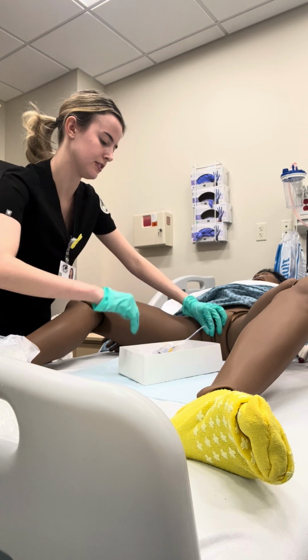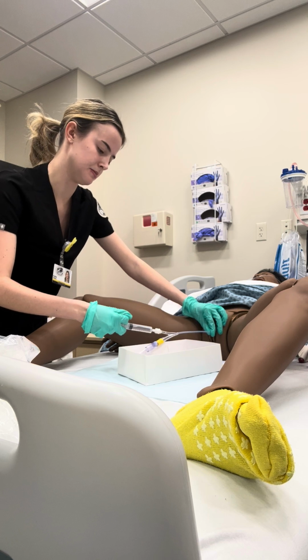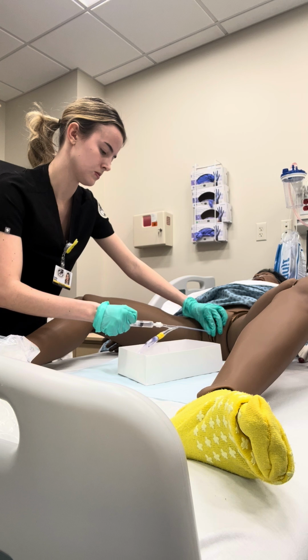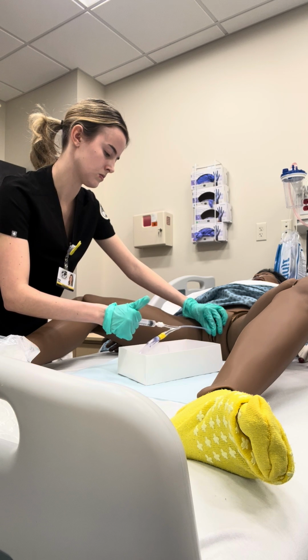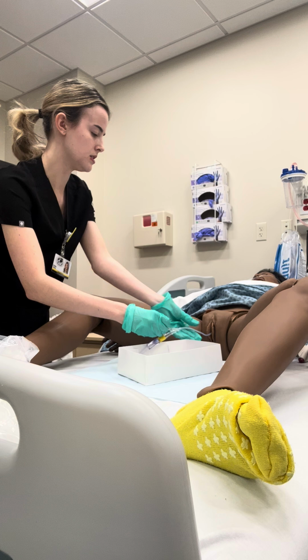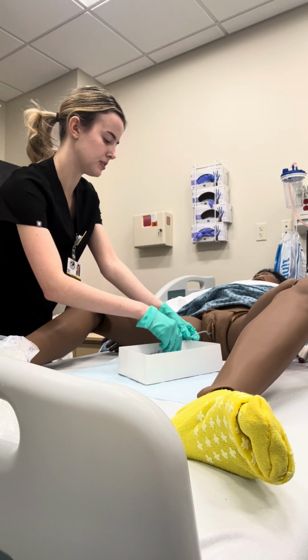I'm going to grab the catheter and inflate the balloon with the 10 milliliters of normal saline. Okay. Then I want to check, make sure there's resistance, and there is, so that means the catheter is in place.